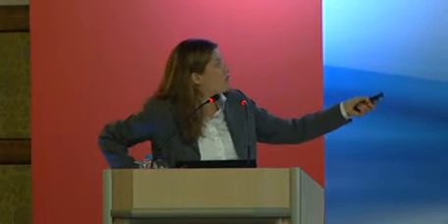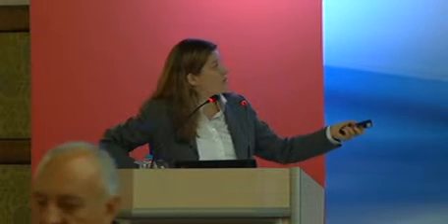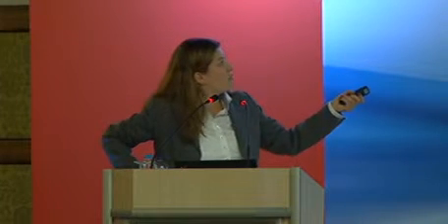It gives us more control. So we saw this adductor roll before. This was coming off from a skin suction socket. Once we rolled a liner on it, what happened was that it elongated the soft tissues, stabilized them, and actually reduced that adductor roll, meaning that we could actually get the socket further up to become more comfortable.